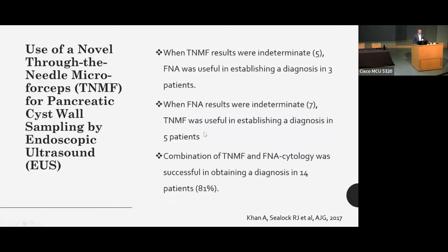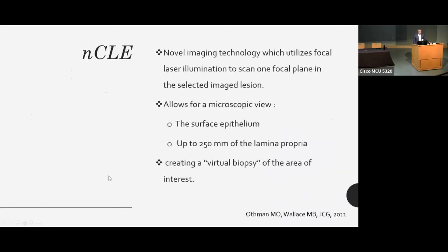And it also can complement your FNB device. So in the study we did earlier, we found that even in cases when you're not able to obtain a diagnosis, the microforceps biopsy would help, and vice versa too. So when you combine both of them, you get a diagnostic accuracy of 81%, and that's what's published in all studies in the literature right now. So finally, virtual biopsy through NCLE, which is a confocal endomicroscopy.